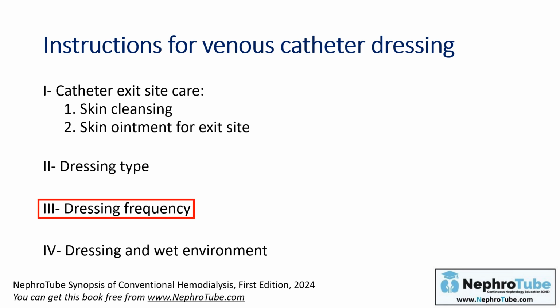Regarding dressing frequency, for sure you have to change the dressing every dialysis session. But if your patient is not dialyzing 3 times per week, for example you are starting incremental hemodialysis for this patient, then the dressing must be changed a minimum of once a week.